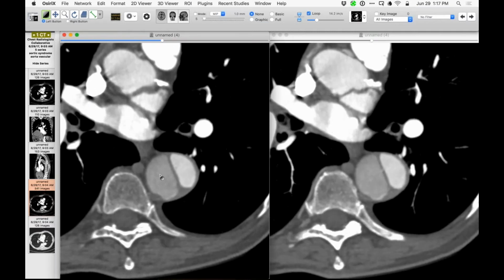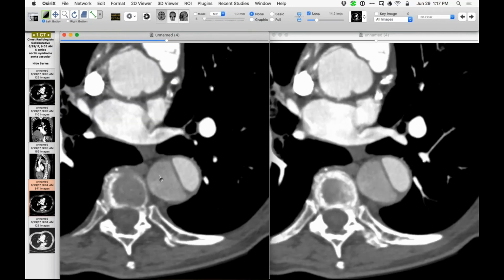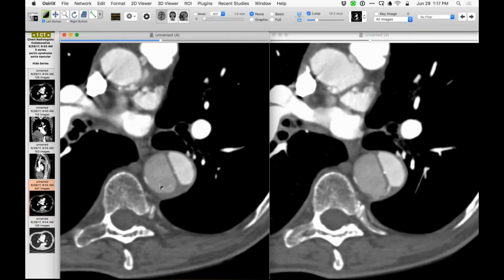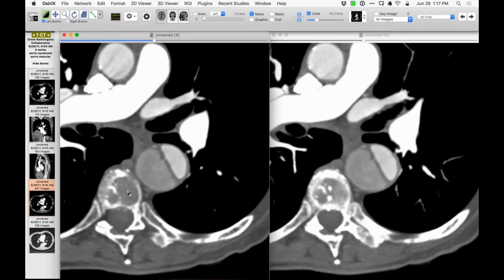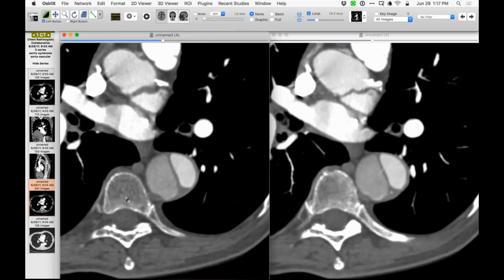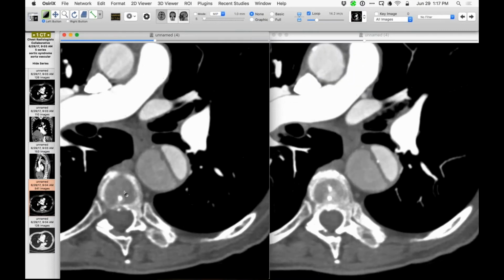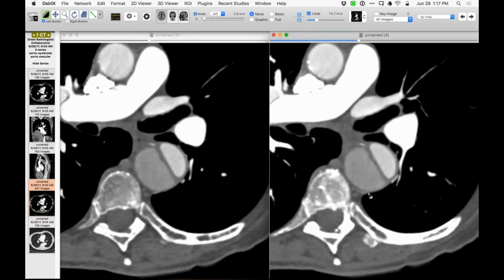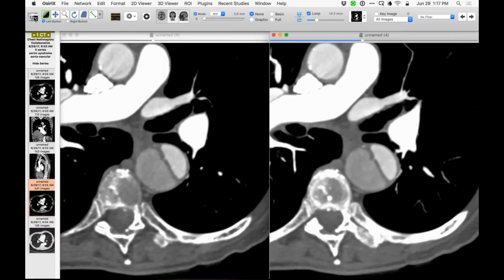Yeah, I didn't think about that per se. I have to think about that. But I'm not sure I've noticed this before. We obtain thin cuts now, and I just happened to notice it in this patient, and haven't really thought about the implications of that, other than I'm sure this occurs a lot. We just don't see them, right? Okay.